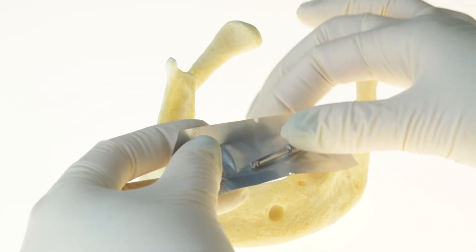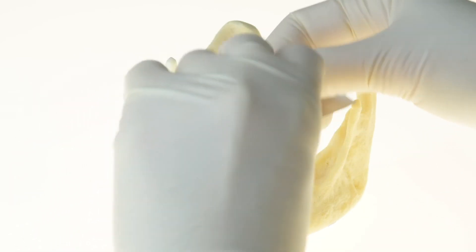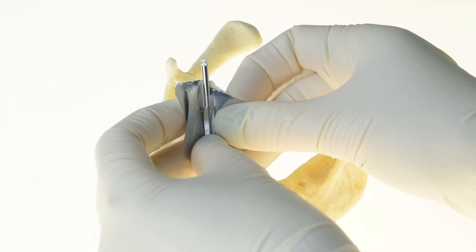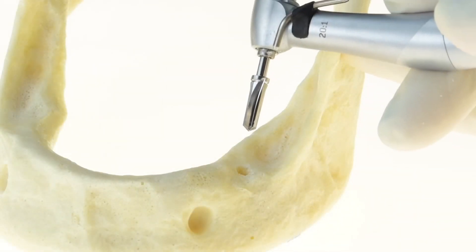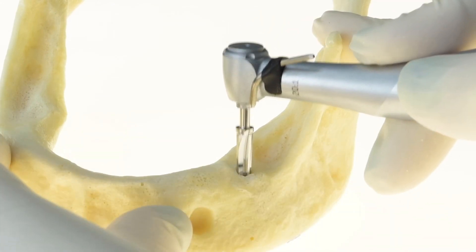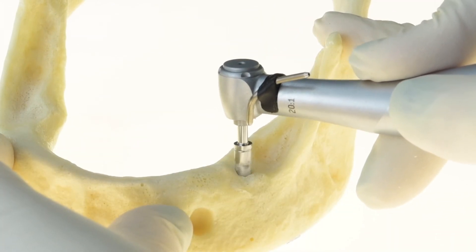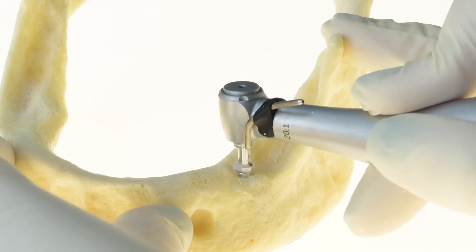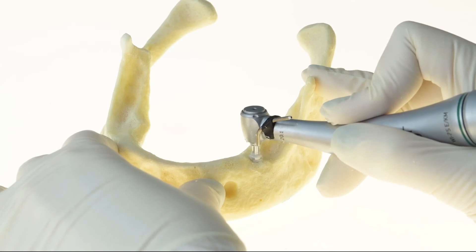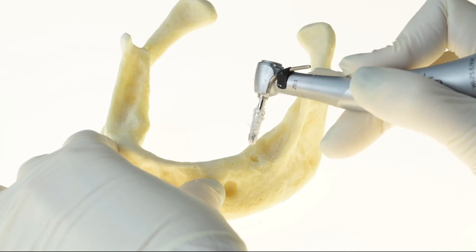At this point, we are ready for the sterile, single-use final drill which is perfectly compatible with the implant we've chosen to place. Once we've finished the drilling sequence, we are ready to place the implant.